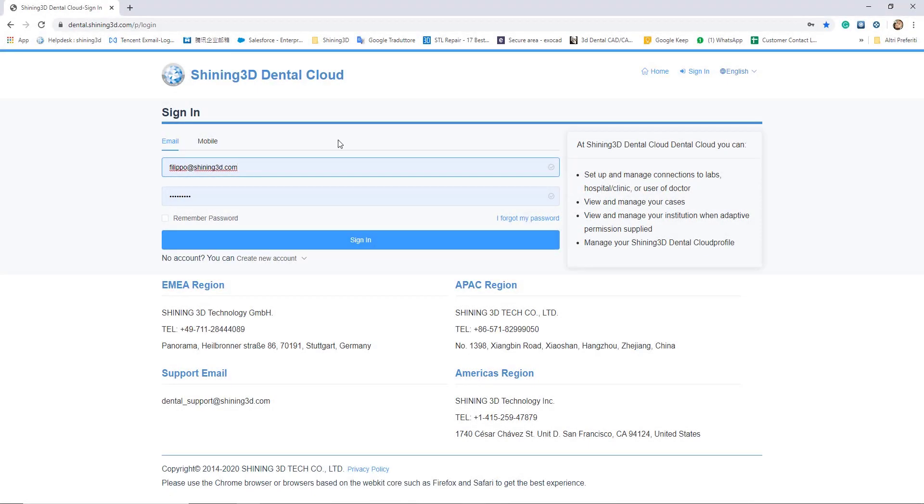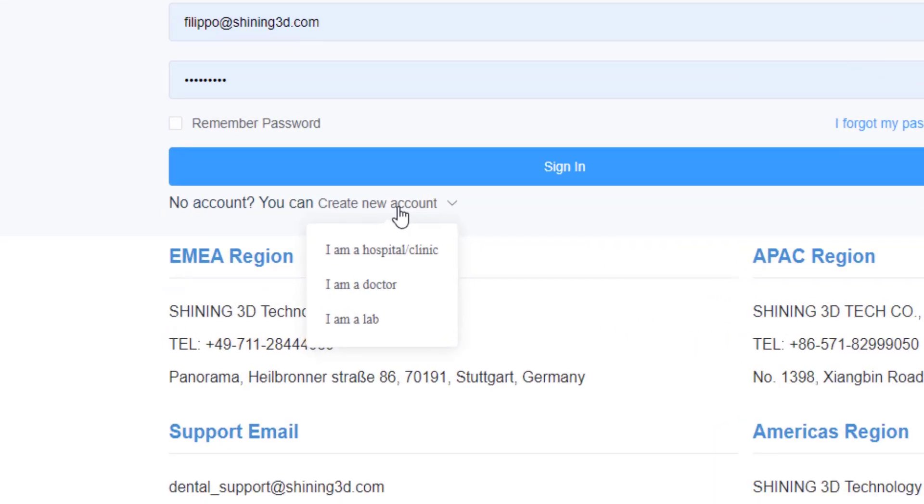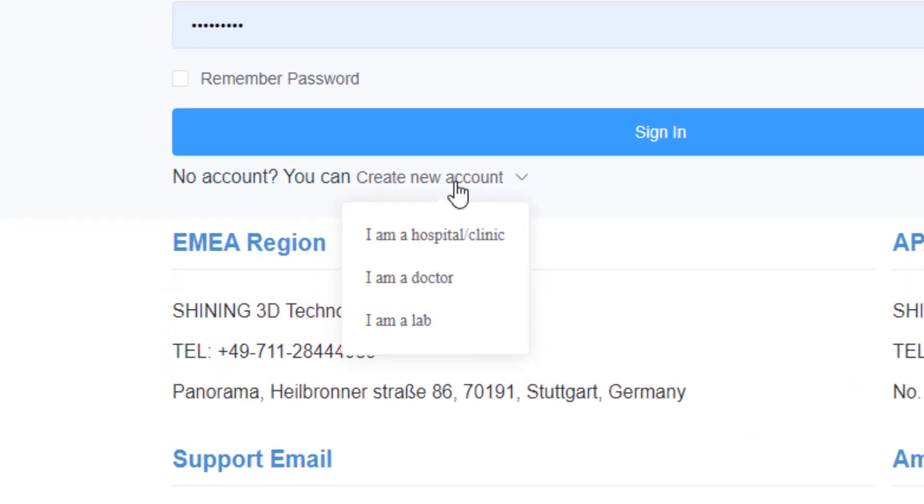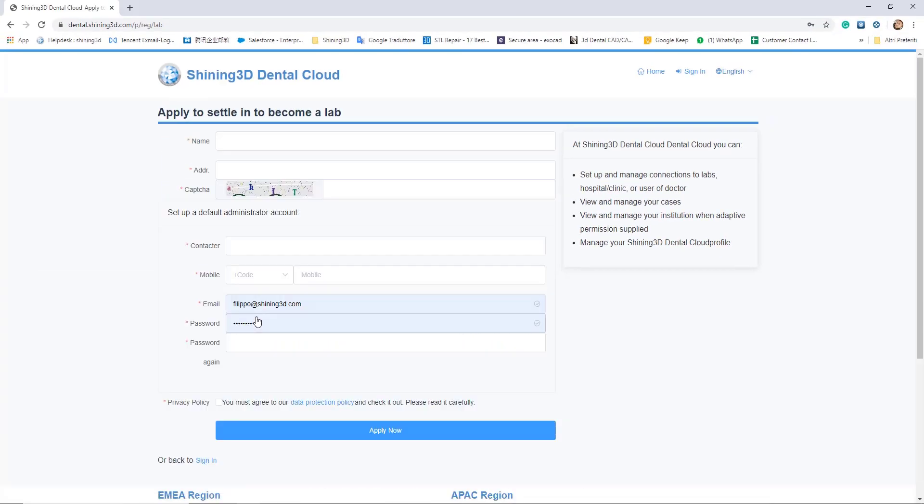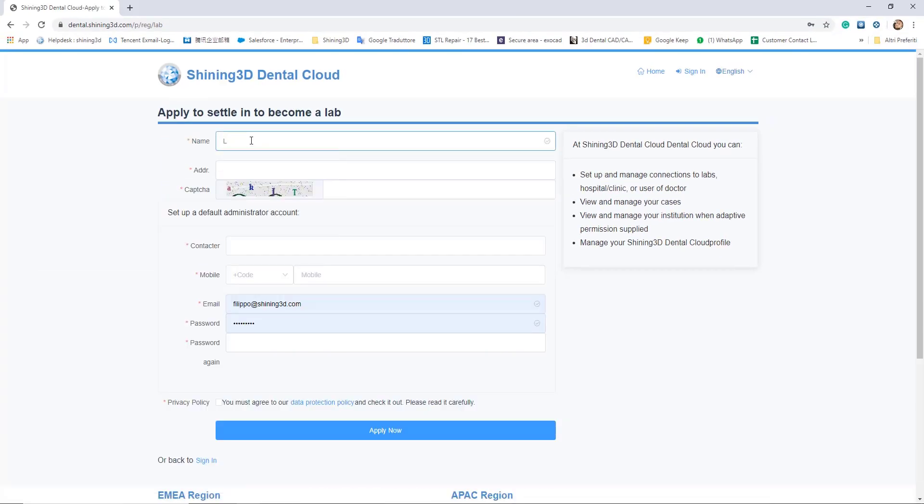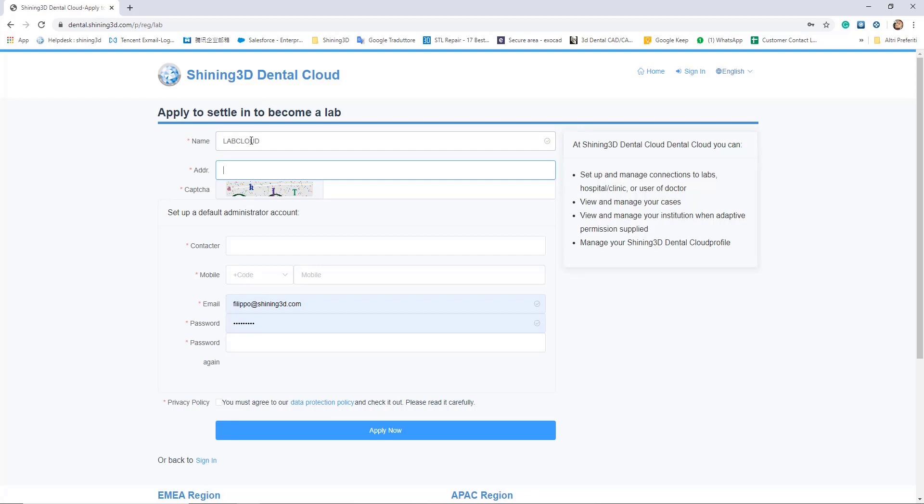Here's the page where it's possible to create a new account. It's just necessary to click on create new account. It's very important to select if you are a doctor, a lab, or a hospital clinic. This step is very important because it's possible to connect just doctor accounts or clinic accounts with the labs.